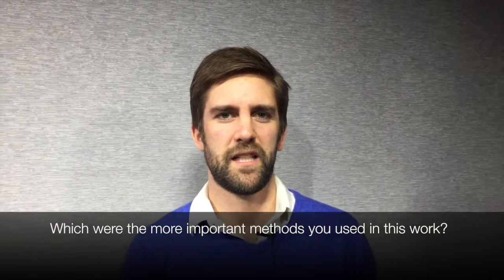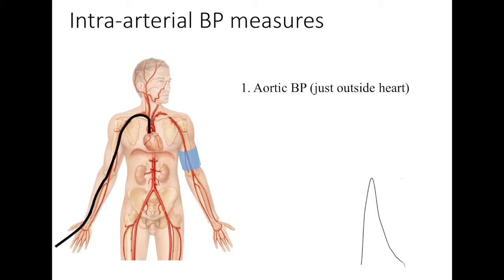We performed standard blood pressure cuff and invasive aortic, brachial and radial blood pressure measurements in patients undergoing coronary angiography at our local hospital. We developed the protocol specifically for this study. At the end of the clinical procedure, the catheter was positioned in the ascending aorta and flushed, and then steady, stable waveforms were recorded for 20 seconds.